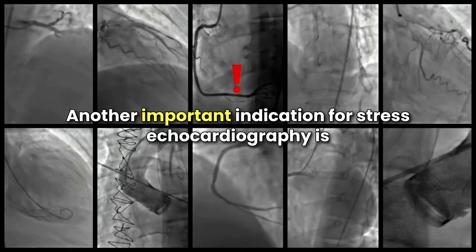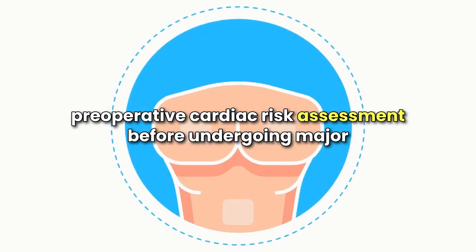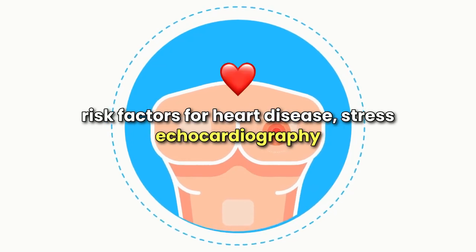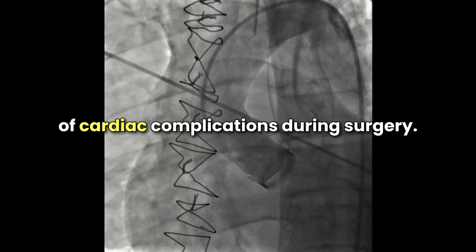Another important indication for stress echocardiography is preoperative cardiac risk assessment. Before undergoing major non-cardiac surgery, especially for patients with risk factors for heart disease, stress echocardiography can be used to evaluate the risk of cardiac complications during surgery.